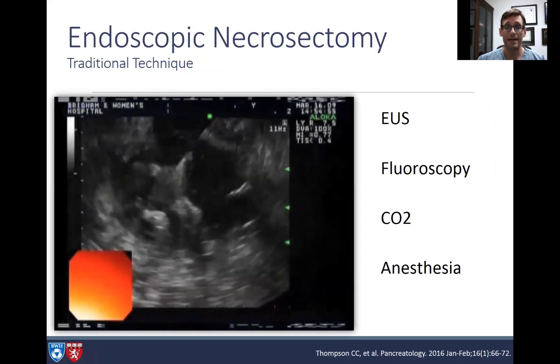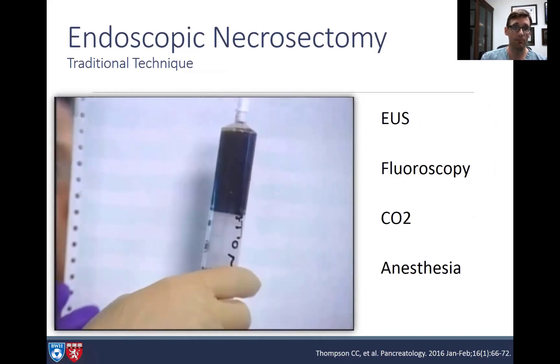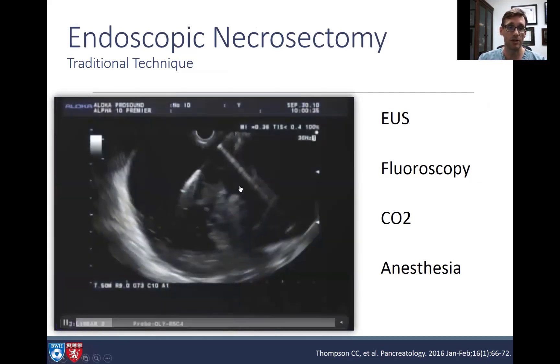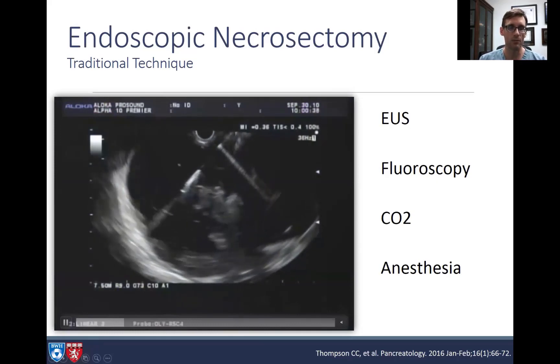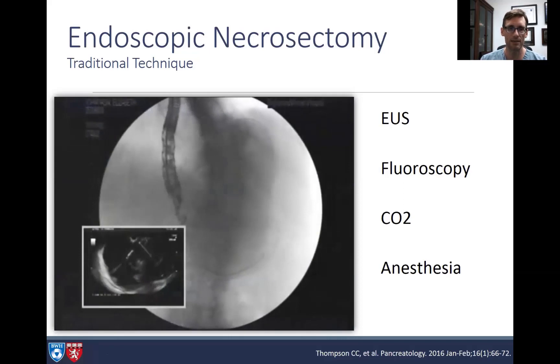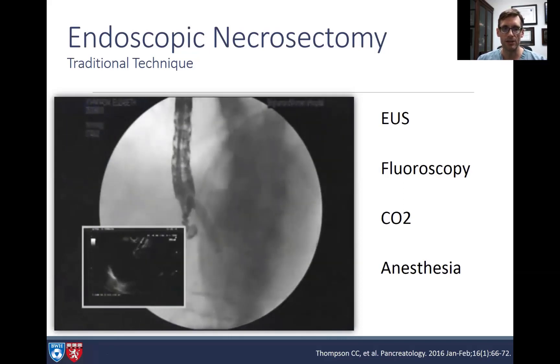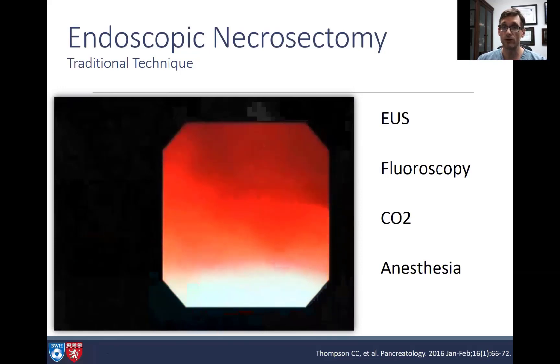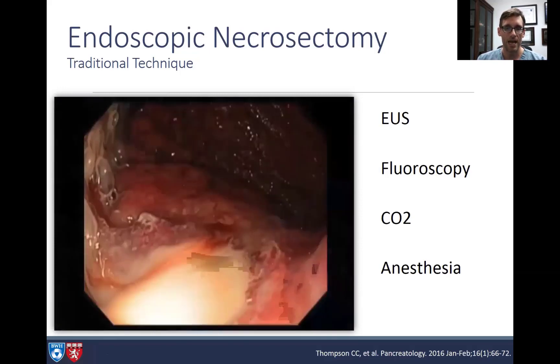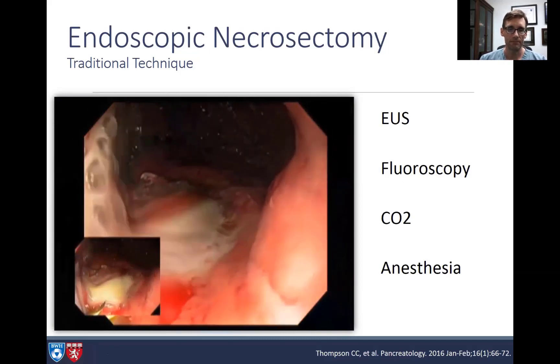The original technique for doing a necrosectomy involves placing a 19-gauge needle into the necrotic collection, aspirating fluid, then replacing it with contrast and placing a wire through the needle. We then remove the needle, balloon dilate the tract — a staged approach using multiple balloons ending with a larger CRE balloon — and gain access to that cavity.